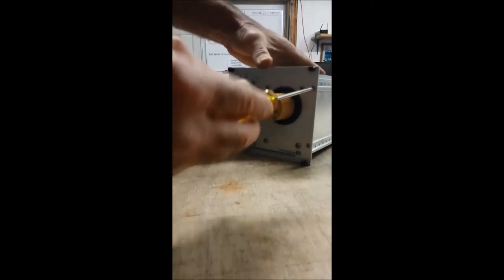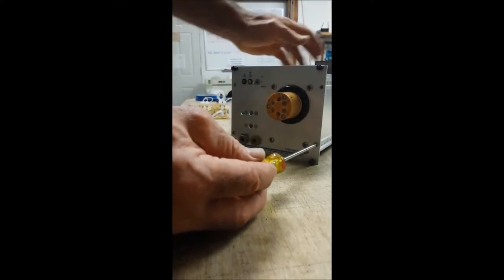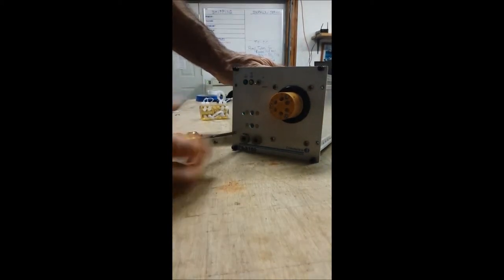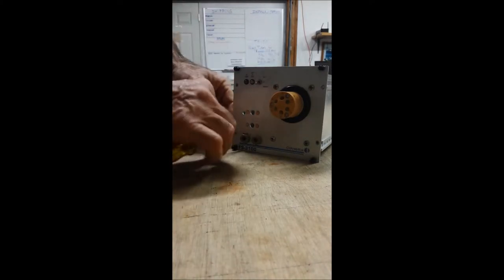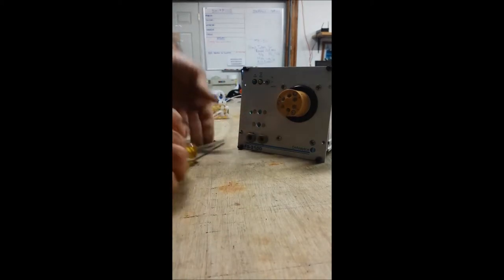And when you do this, it is going to sort of fall apart, so you've got to be a little careful with how you do this. You'll have to have it out of the chassis, and you'll have to have all the tubing removed. It makes it a lot easier. And once this fourth screw is out, if you do have the top plate in here, you'll want to slide that out. It's not really necessary.